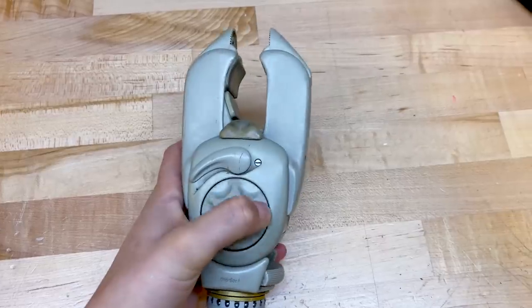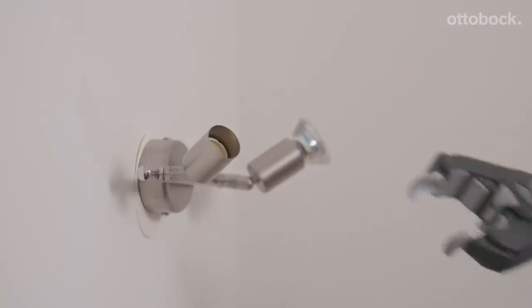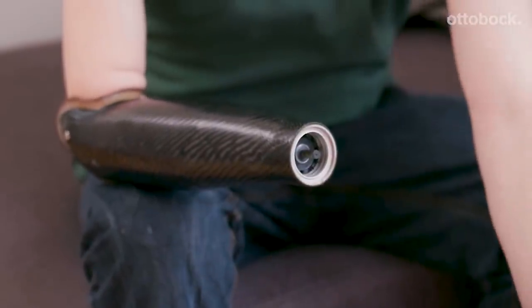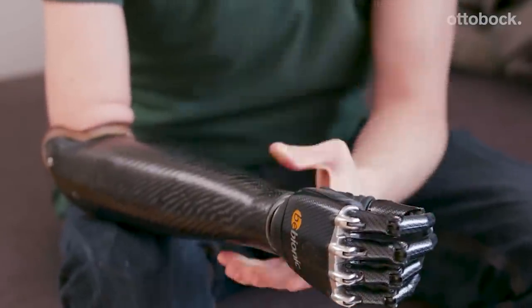And depending on the type of activities a person is doing, there are actually different types of myoelectric devices. For example, there's one called the Greifer, and it's a lot more sturdy and works really well for manual labor like farming. Some models even allow a person to switch between a Greifer and a hand device depending on what they're doing at a given time.